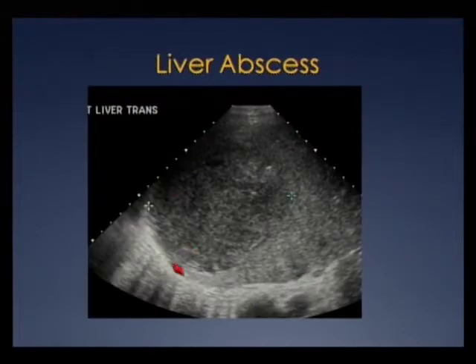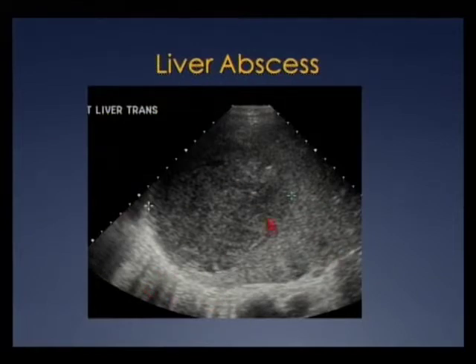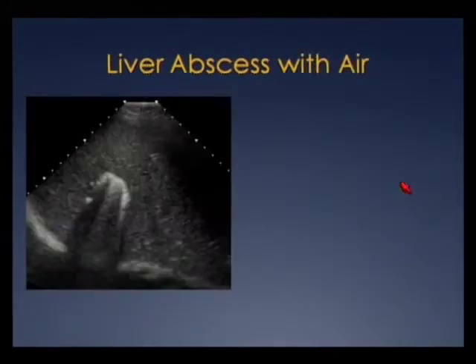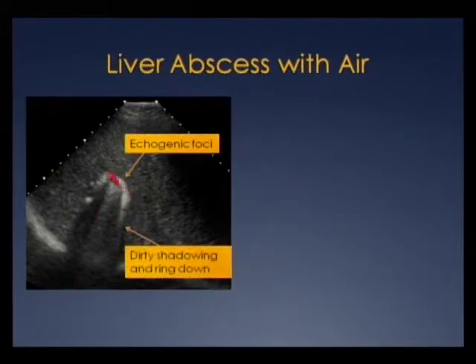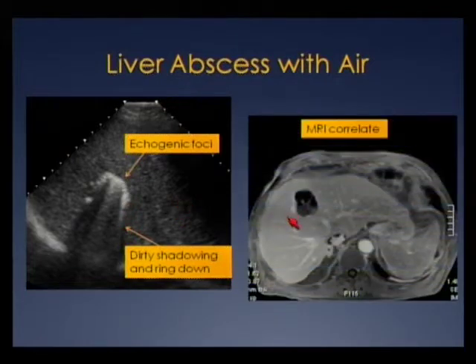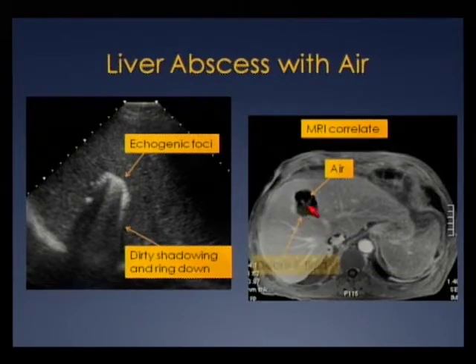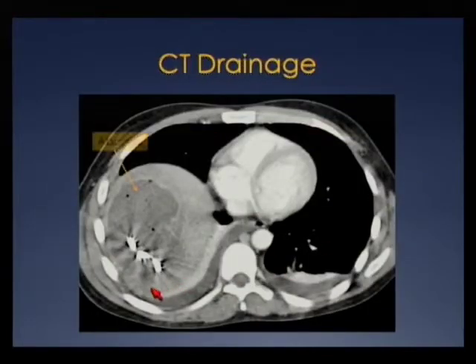Here's a large complex hypoechoic lesion in the right lobe with diffusely increased through-transmission and no Doppler signal — this was a liver abscess in a very sick patient. In another patient, we see multiple echogenic foci with ring-down and dirty shadowing in the right lobe — the hallmark of air. Air is echogenic with dirty shadowing, unlike the clean shadowing from stones, plus ring-down artifact. On MRI T1 post-contrast axial, areas of signal void correspond to air with a hypointense focus of debris and fluid, confirming the abscess.